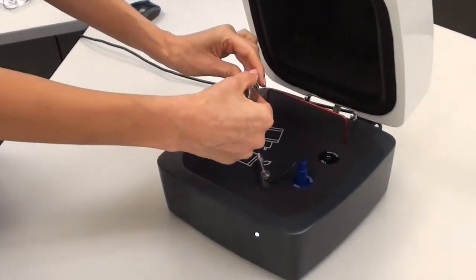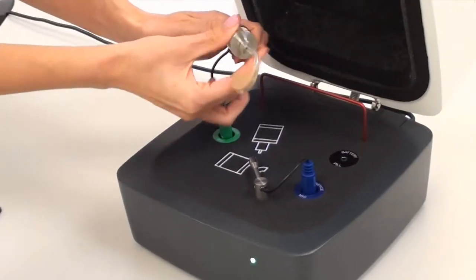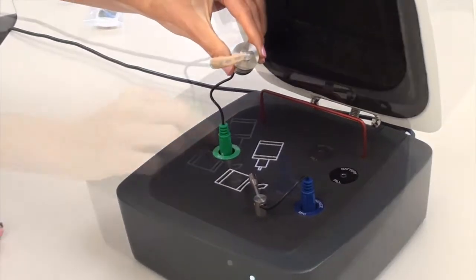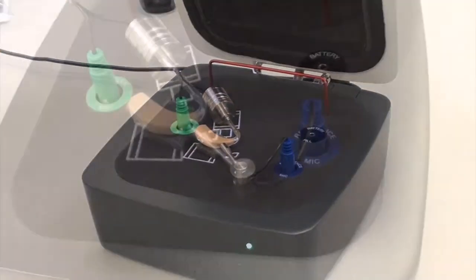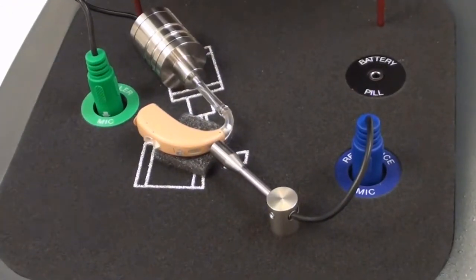Attach the 2cc coupler with the BTE adapter to the coupler microphone. The hearing aid should also be the same height above the foam surface as a reference microphone. You can use the foam pad included in the kit if necessary.